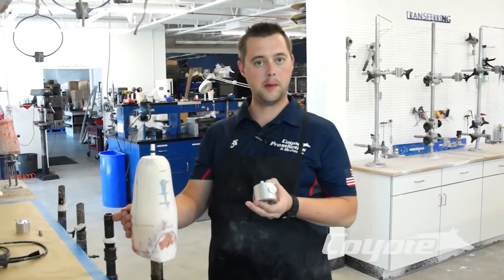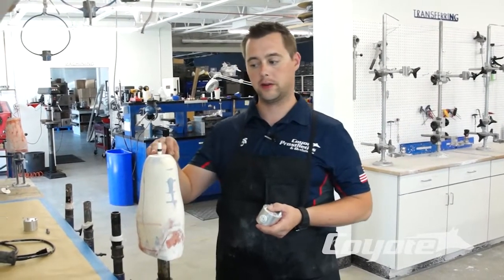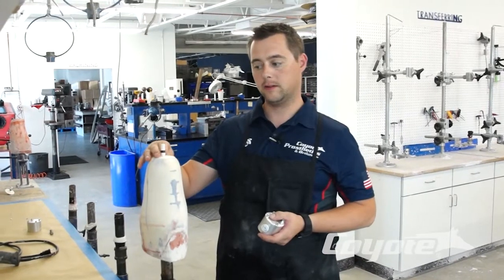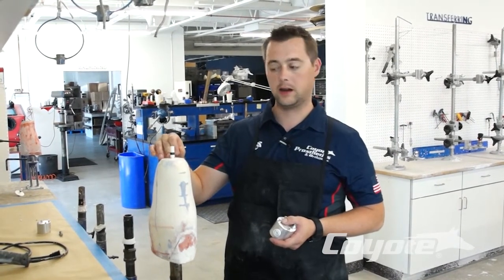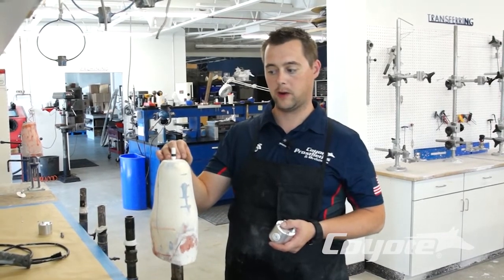Today I'm going to show you the drop-in lamination on a trans-tibial socket. Here we have a socket, a mold that already has an anchor on it. I'm going to go ahead and show you the anchor way.